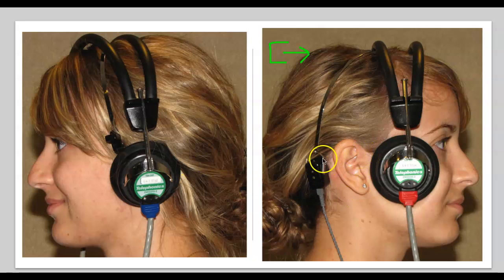If we flipped it and then we put the bone conduction oscillator on the left ear and put this on the right ear, then we would have a left masked bone score. Okay, so remember, right unmasked is here, left unmasked is here. That just shows where the oscillator is in location. If there's no masking. If there is masking in the opposite ear, then you can say for sure that that bone conduction score is coming from either the right or left ear. So without masking, this is an important point, without masking in bone conduction testing, you cannot be sure exactly which ear the response is coming from because interaural attenuation is 0.